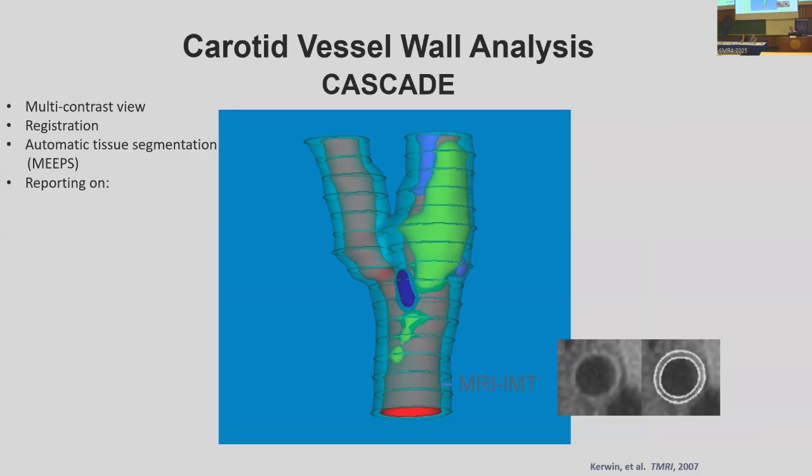And this is also where we started. If you think about vessel imaging, most of the imaging research may actually be focusing on how to improve the image quality, and then you can see things better. But in this case, once you move from the beginning point of looking at vessel wall, the so-called how atherosclerosis, how does it look like on imaging?